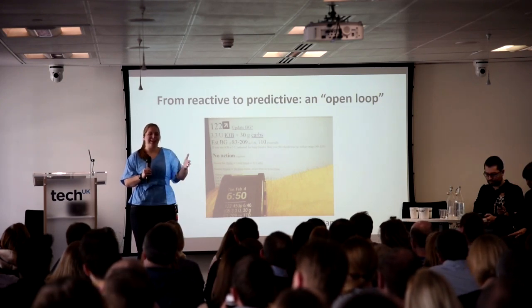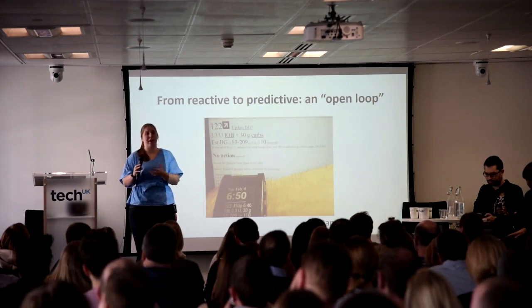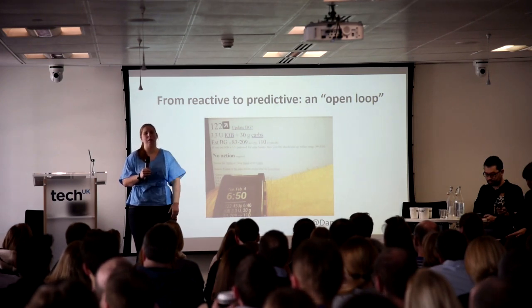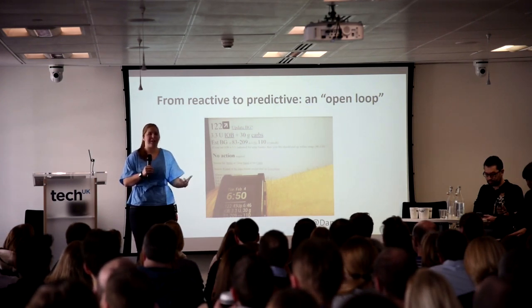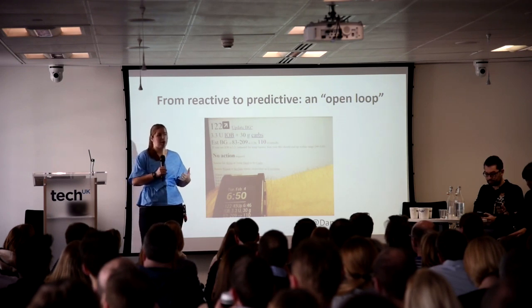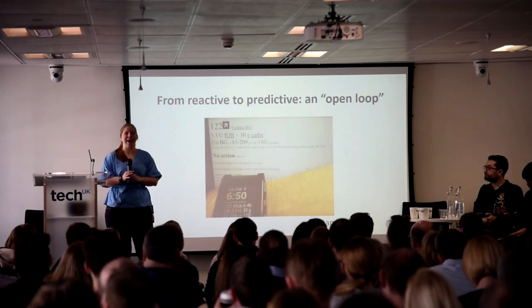So I slept through it, but we also built in remote monitoring capabilities. This was before Nightscout actually came to be, and I was able to send alarms to my then boyfriend who lived 20 miles away. He was able to get the alarm and say, hey, she's been under 60 for 20 minutes, she's not doing anything. Let me pick up the phone and call her and check on her. And he did, and that was able to wake me up, and obviously I'm alive here today.